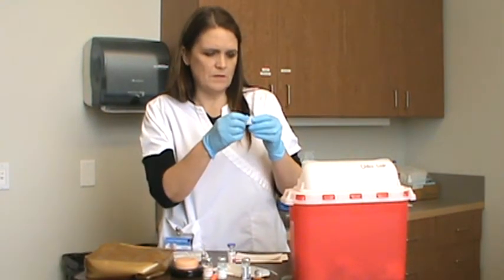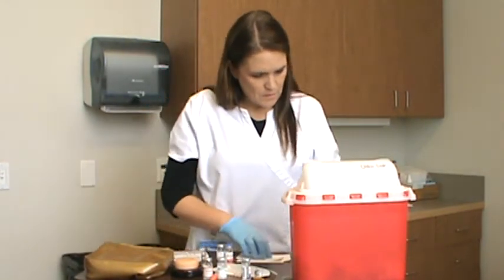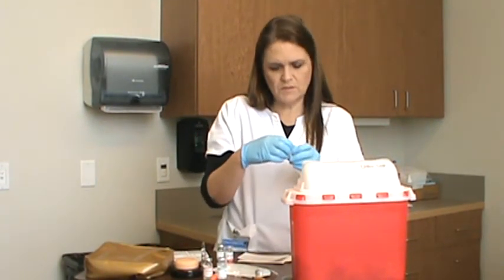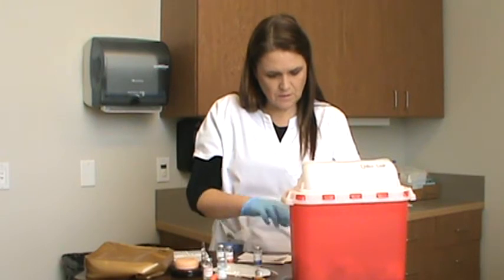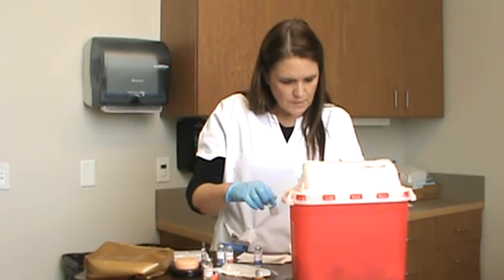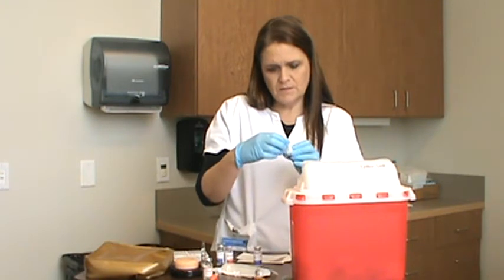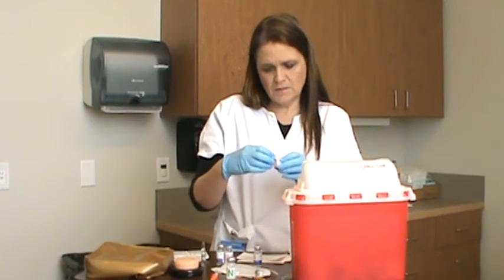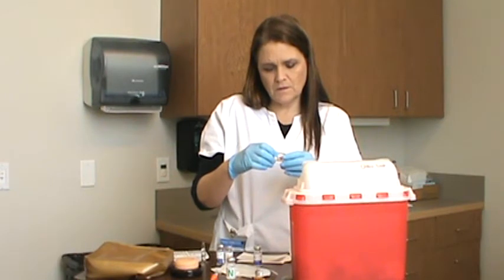This is my sterile water. It expires 11/20/24. Then the tuberculin test. This is 0.1. This is the tuberculin vial, and it expires in 11/20/24. So that one's good. Then she gets insulin, NPH, 16 units, and regular insulin, 9 units sub-Q. This is the NPH, and it expires 2020. And this is the regular insulin, and it expires in 2015.